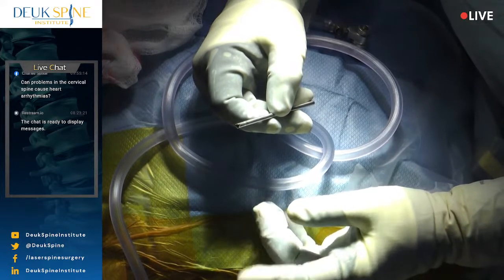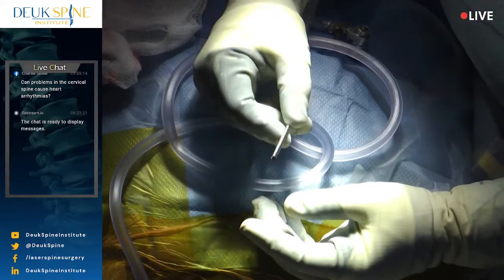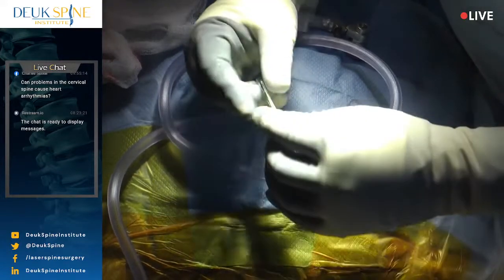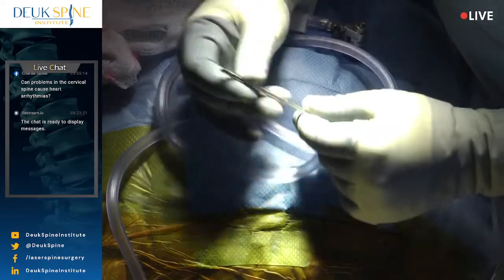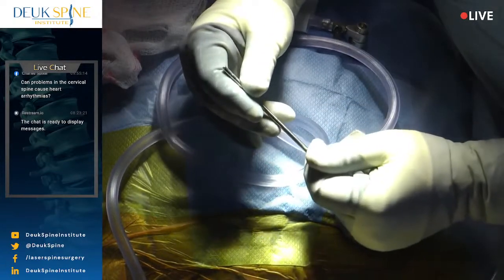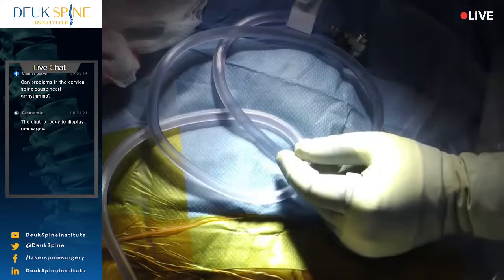So that TV can stay on camera view. This TV can go to my endo view. All right, so there it is. The whole surgery will be done through this tiny metal tube. It looks like a coffee straw. I assure you it's much more expensive. And it's stainless steel, it's FDA approved, made in Germany. And that's where we're gonna do the whole surgery through.